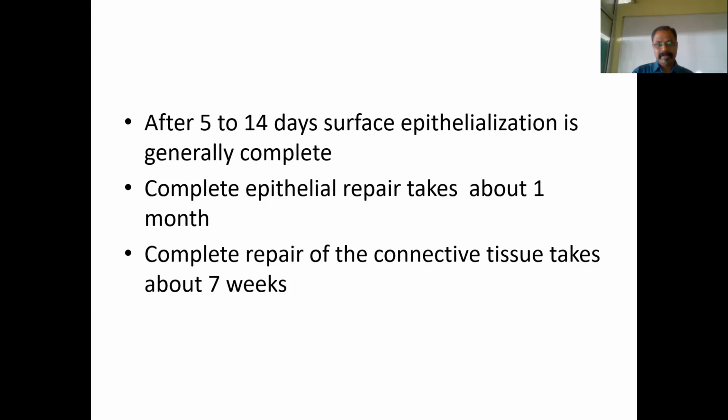The incision used for gingivectomy is called an external bevel incision, and you can use either a continuous or a discontinuous incision. The instruments used are the Payne Kaplan pocket marker, which delineates the pocket depth, gingivectomy knives, and scalpels. Then you use a curette to do root debridement, and finally place a periodontal pack. So this finishes the topic.